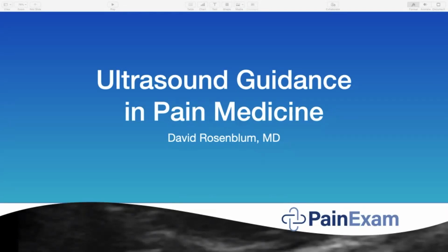So it looks like most of you are anesthesiologists and almost 80% of you are pain physicians. And the content that you requested that I focus on mainly would be nerve blocks, then to a lesser extent, joint injections and fascial plane blocks. I will be doing other webinars in the future with more focus on the fascial plane blocks, but I do have quite a few here today.